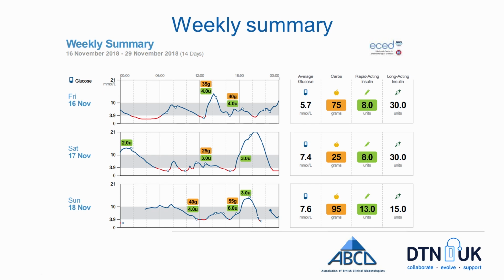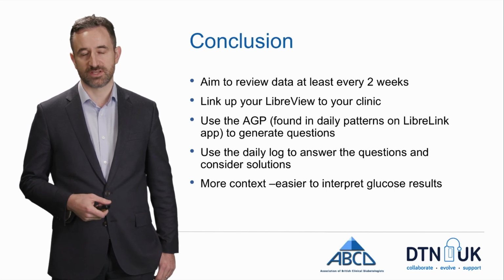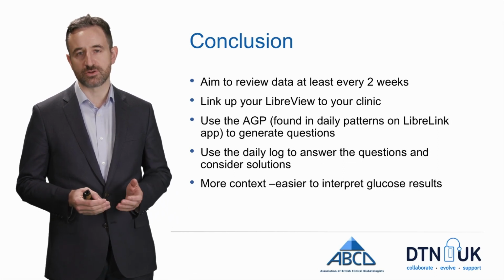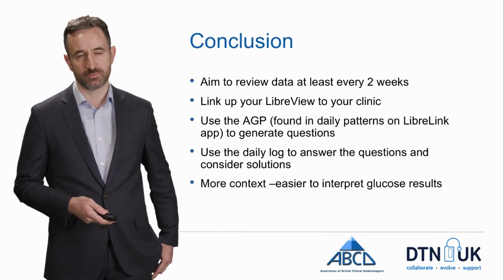So to conclude, we would recommend people using the Libre review their data on the LibreView system at least every couple of weeks. It's much more effective than looking at the very small screen either on your mobile phone or on the reader itself, which can be quite difficult to interpret.